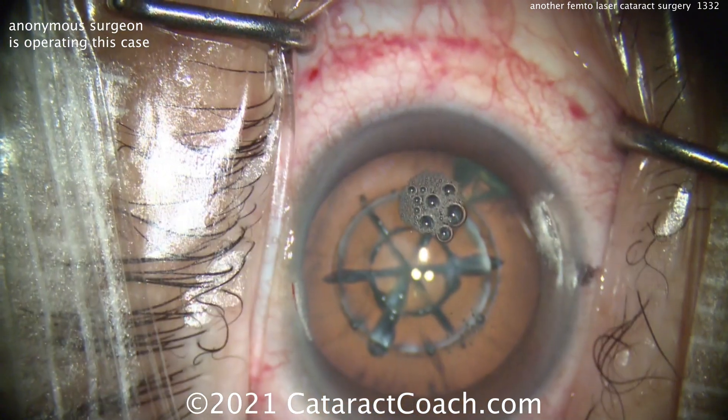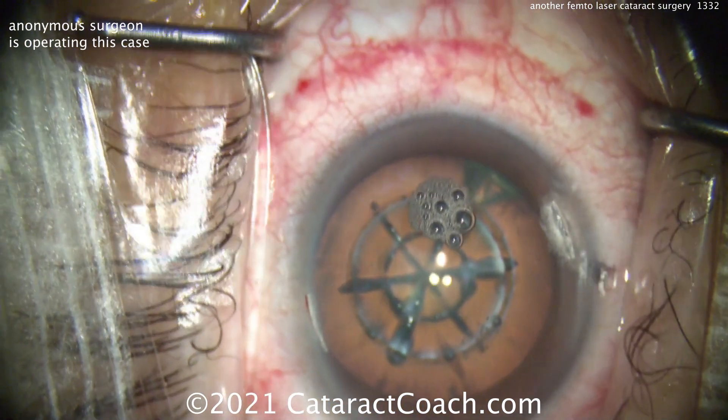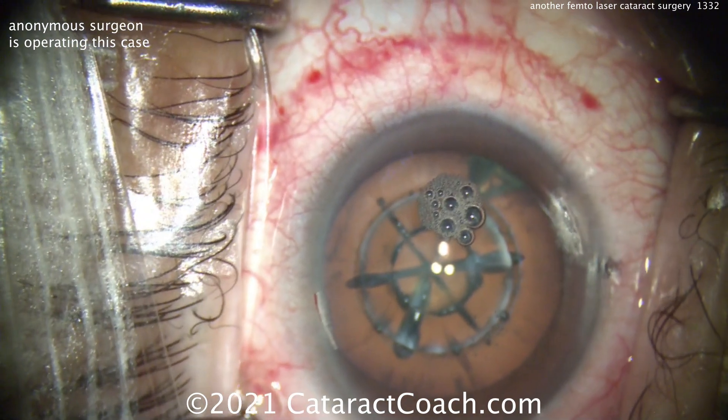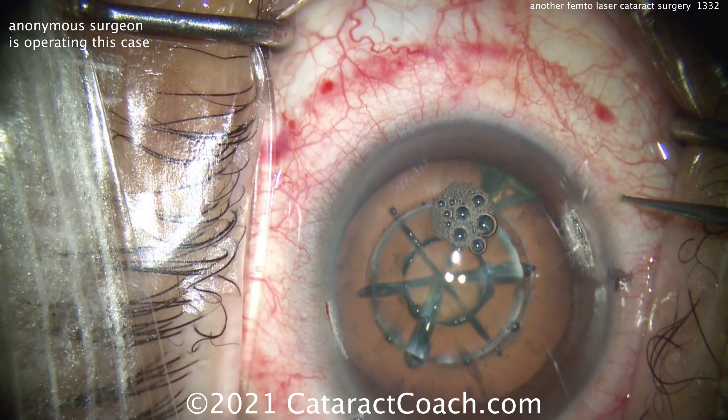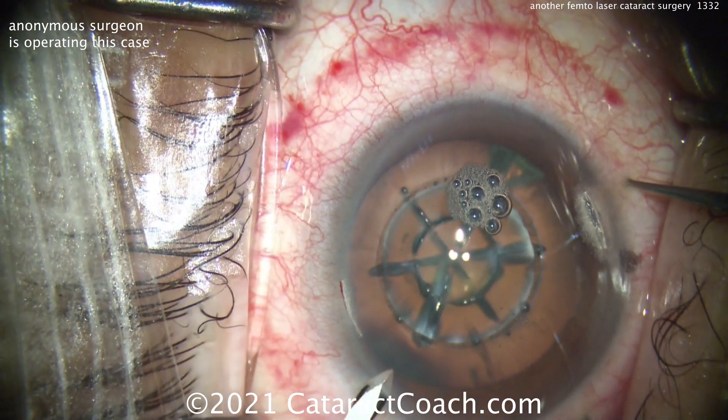You can see there's that subconjunctival hemorrhage — that's the telltale sign from the suction ring of the femtosecond laser. Good-looking draping here, all the lashes out of the way, lid margins sequestered. You can see there's an astigmatic treatment in the cornea, approximately the with-the-rule meridian.